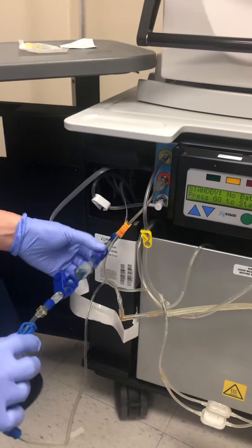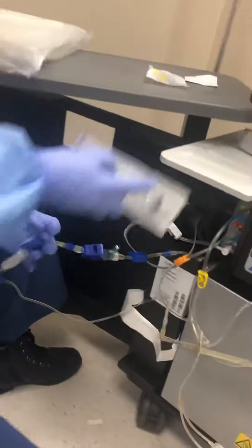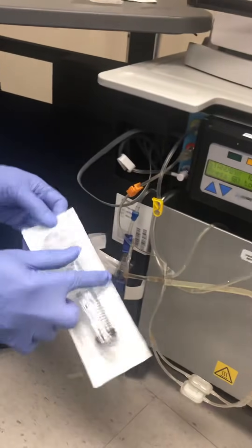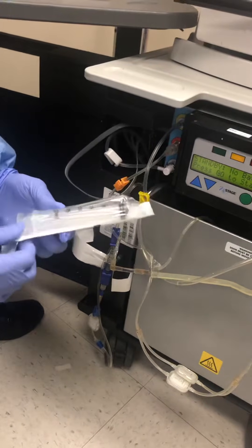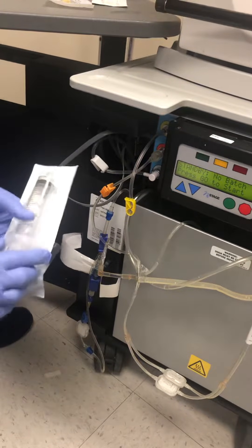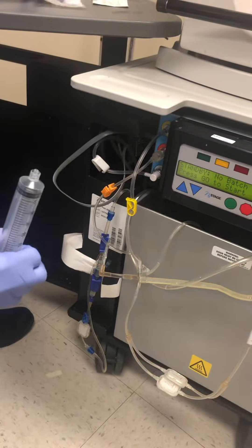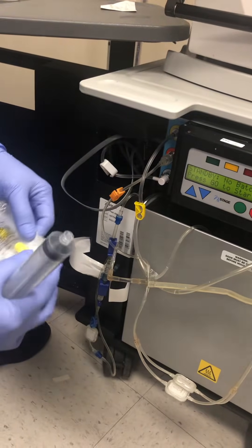Make sure that these two blue clamps are closed. You prepare your syringe — I have a 30cc syringe, but if you have a bigger syringe like 60cc, that would be better. And a male-to-male adapter.